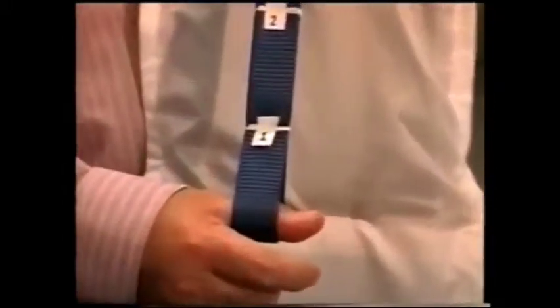Number one, number two, number three, number four, number five, and number six up here. These are all different settings that you can put the sling onto, right? So when you put the sling on, for different patients, you might use a number three setting, or a number two, or a number five, depending on if you want them sitting upright or reclining back, and also on the patient themselves, where their weight distribution is.